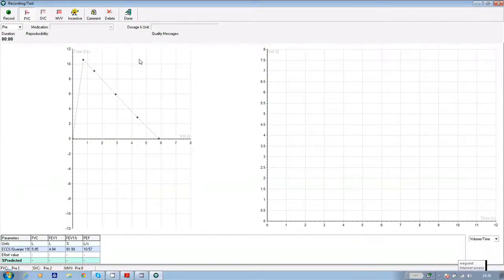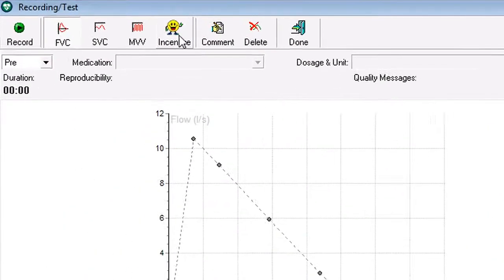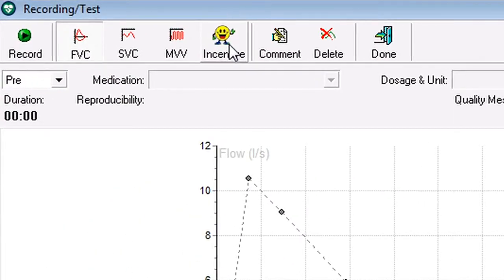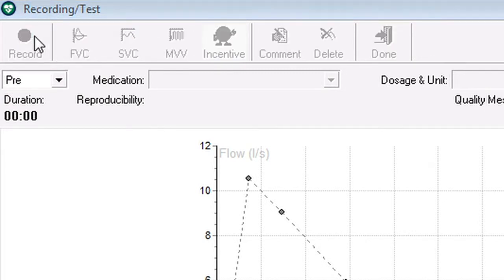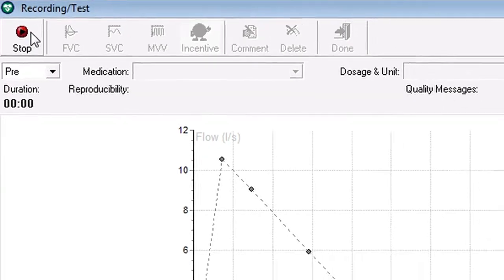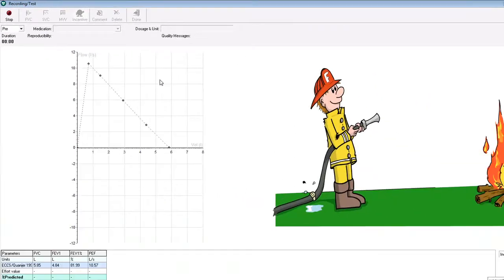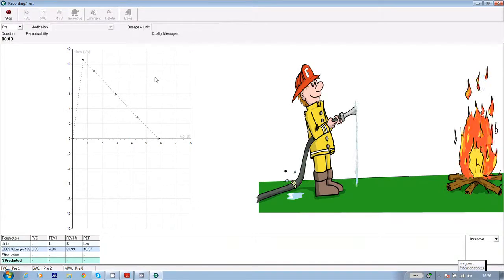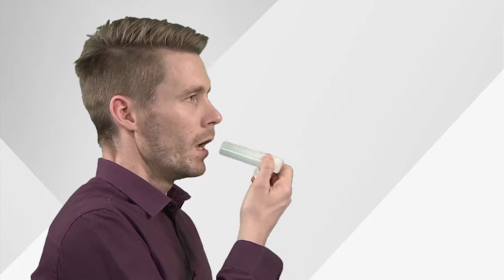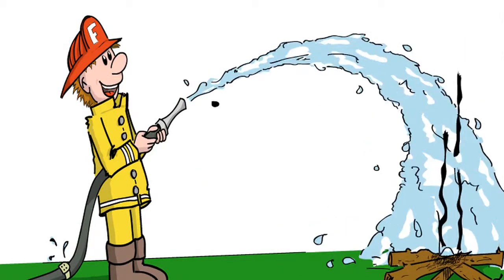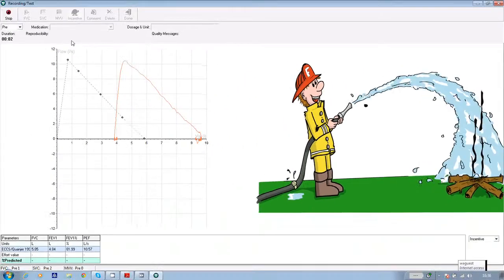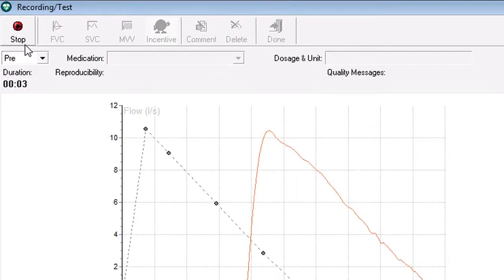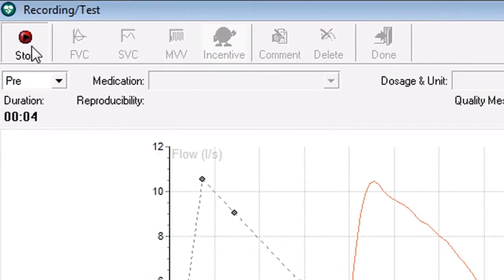If you want to give the patient an incentive to blow harder, click on the incentive icon at the top of the screen, followed by record. The patient should breathe in calmly as before, place the sensor in the mouth, and blow out as hard as they can. If they blow hard enough, as you can see, the fireman will put the fire out. At the end of the effort, click on stop.